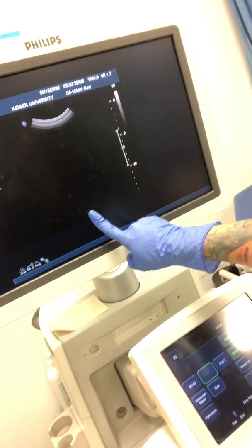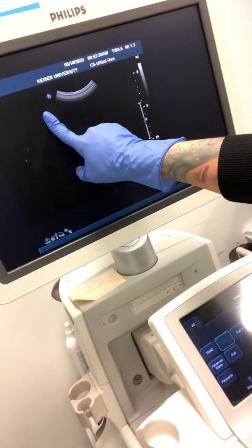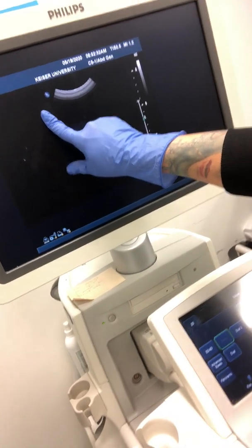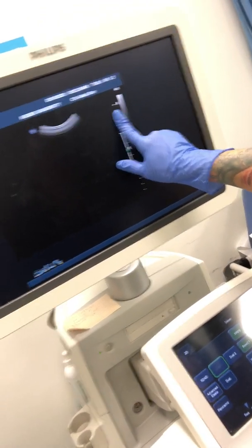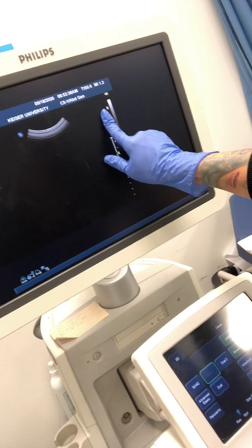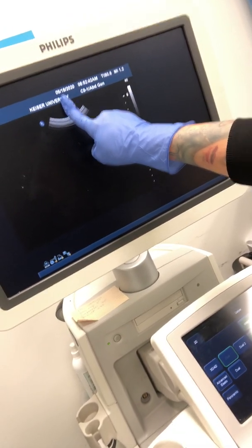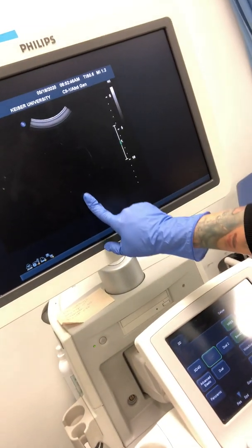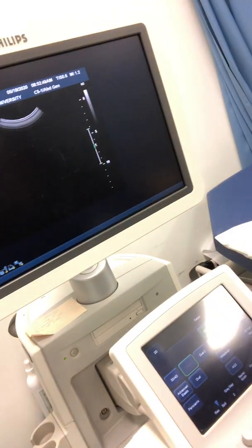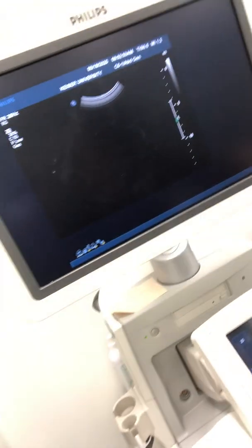In transverse, the notch would be pointing towards the patient's right-hand side, which would make the exact opposite side of the screen, or our right, the patient's left-hand side, and we have not moved our probe, so we are still scanning from the patient's anterior to the patient's posterior. Because again, the sound beam travels into the body, and in this particular case, since we're going from the anterior portion, it can only travel posteriorly.